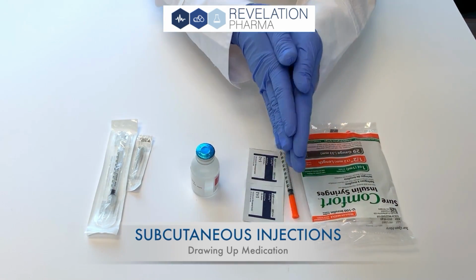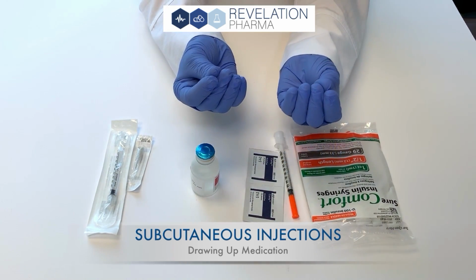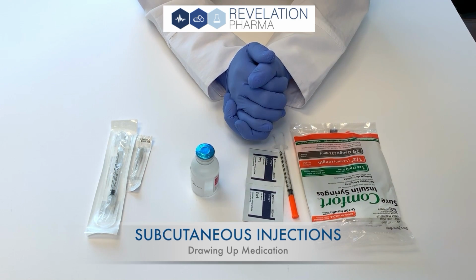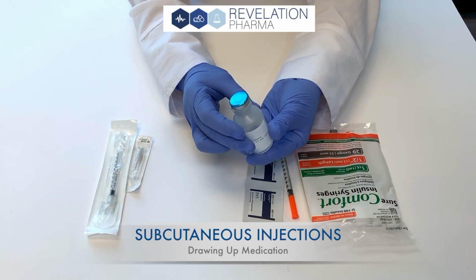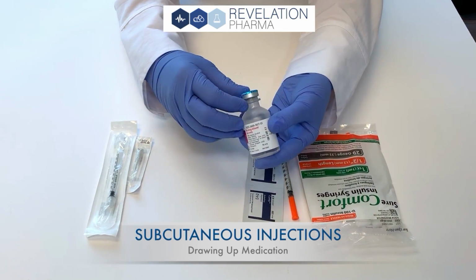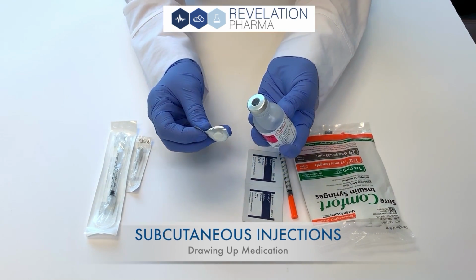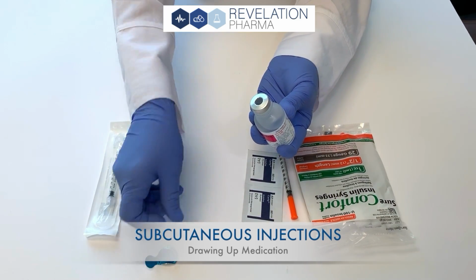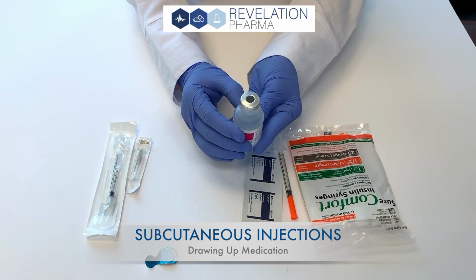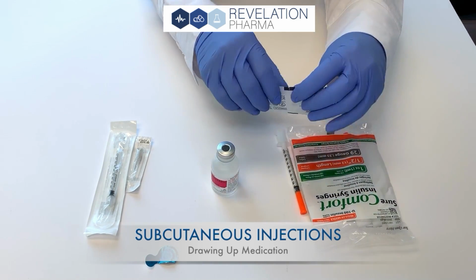Always wash your hands prior to getting ready for the injection. You can wear gloves to give the injection, and some people prefer to have a bandage open to cover the injection area once complete. To prepare the vial, remove the tamper evidence seal that is on top of the vial. This can be discarded or placed back on top after use, but does not aid in the sterility of the vial.